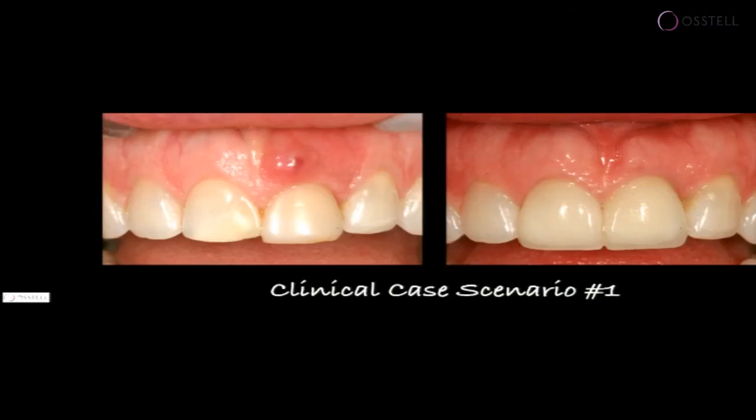And we can see that if you look at the most difficult spot for me to manage, which would be the papilla between the central and lateral incisor. There's symmetry in this case. The right side looks like the left side. And I have tried, as I'm sure everybody in this room has, to recreate this in delayed loading protocols, and it's extremely difficult. On the other hand, if you can immediately load with confidence, and having a measurable stability is part of that confidence, if you can immediately restore this and preserve those tissue contours, you get a better result.